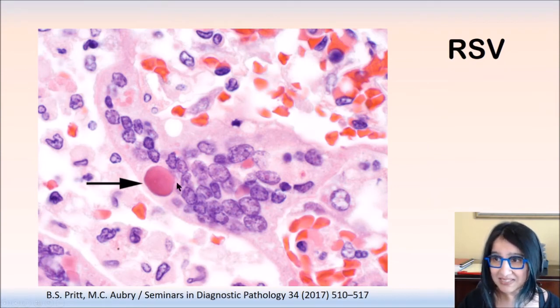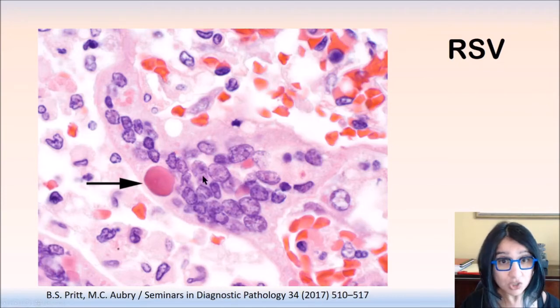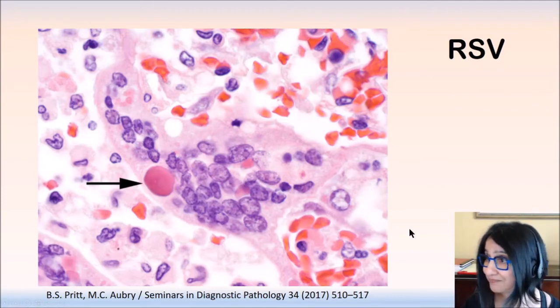Here's another really excellent example of that. So again, a multinucleated cell, and here is that really nice viral inclusion. That characteristic fusion is something you see in many paramyxoviridae. So those paramyxoviridae, besides RSV, include measles. So if you have a situation where you have a measles virus, it's going to look really similar.